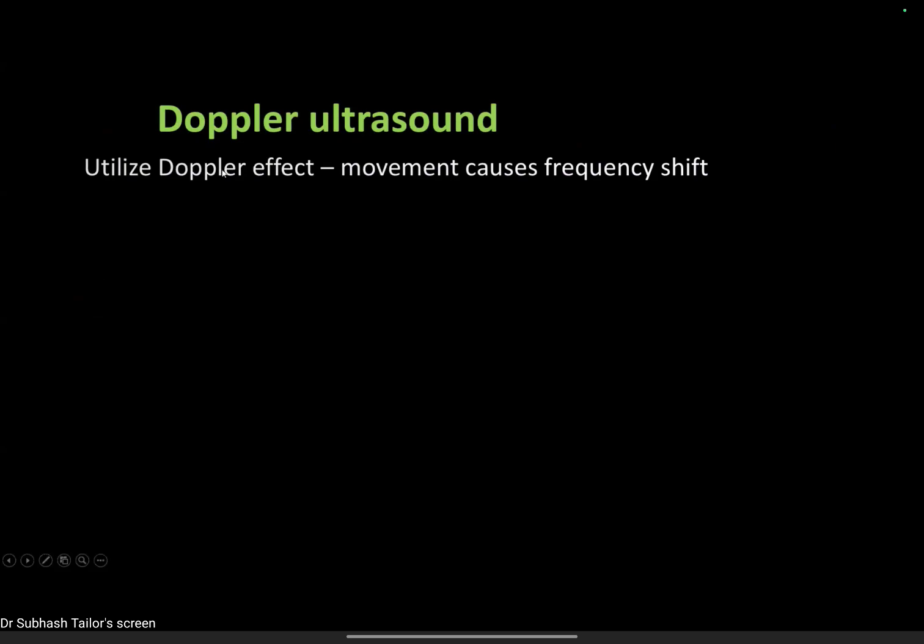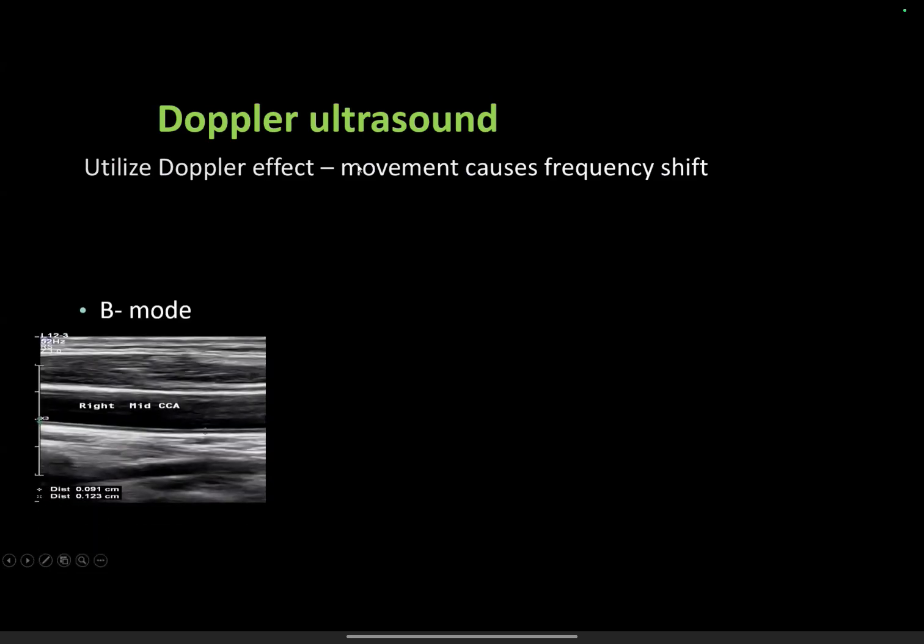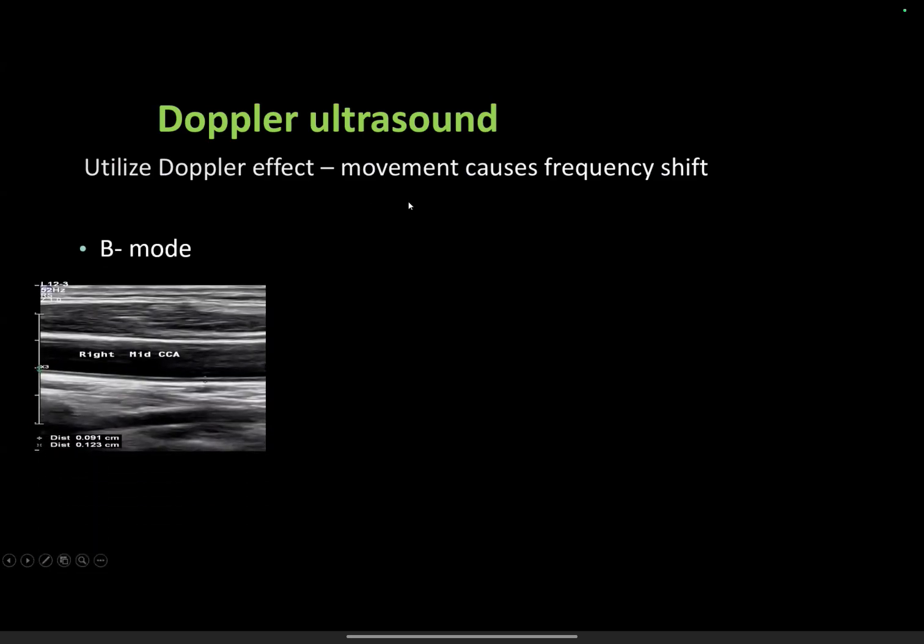So basically, Doppler ultrasound utilizes the Doppler effect, which is nothing but any moving target being struck with an ultrasound beam. The returning frequency is different from the original insonating frequency, and this shift is known as frequency shift, and this principle is utilized in Doppler.